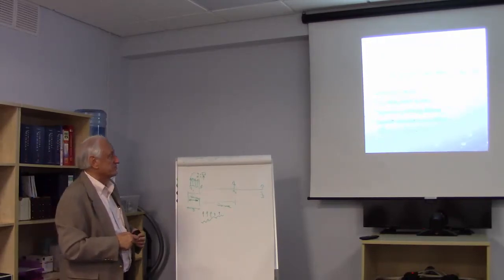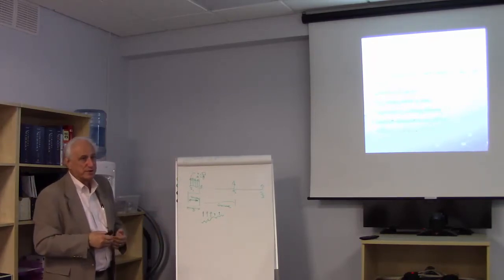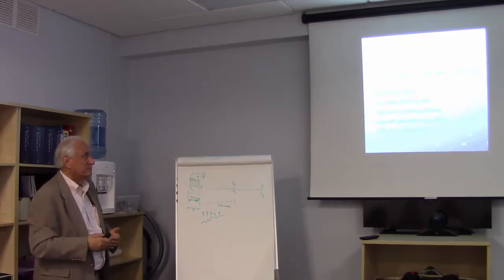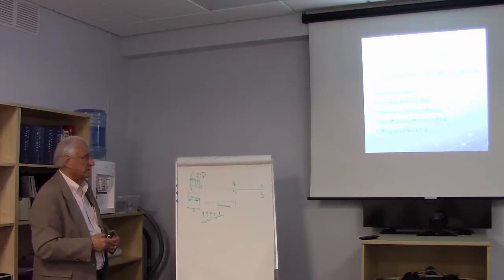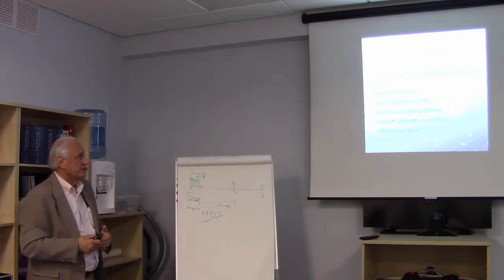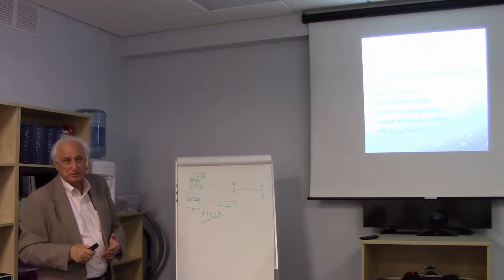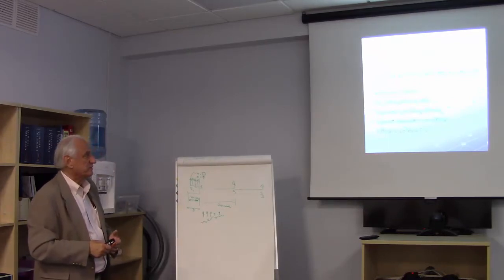So just to summarize those, used during operations in which there is access to the cord. So you really want to be able to get to the cord. We only use them in intramedullary tumors. Any change should be noted. So the D waves are there or they're not there. Same way we interpret the transcranial motor potentials. They're either there or they're not there. The things you got to worry about, recording electrodes can move and then therefore produce an artifactual signal. So kinds of things we deal with all the time.